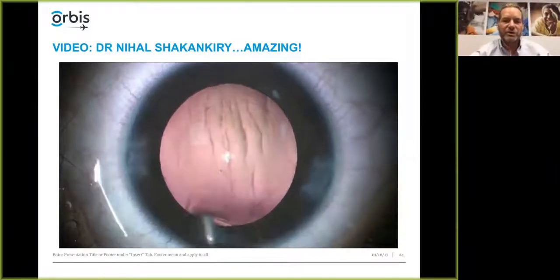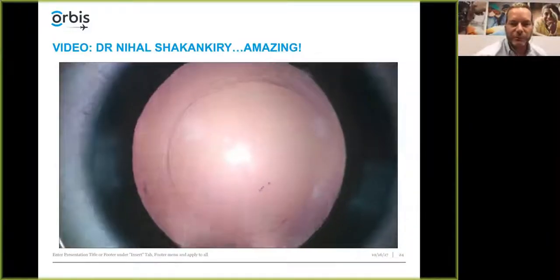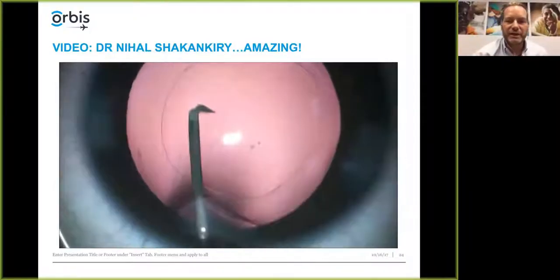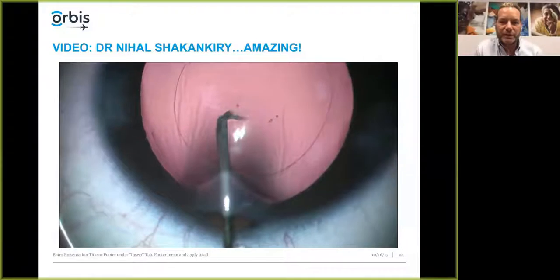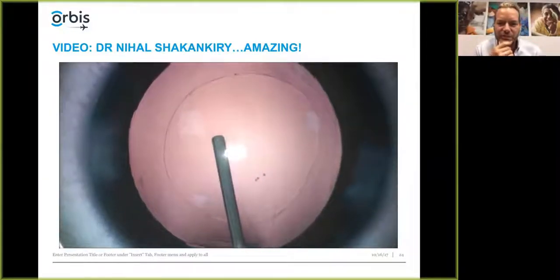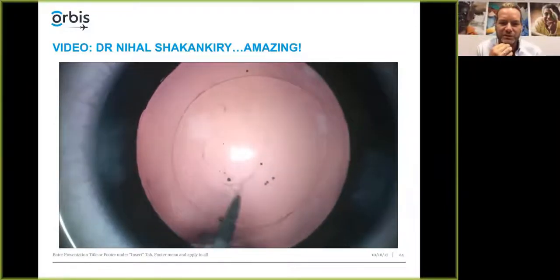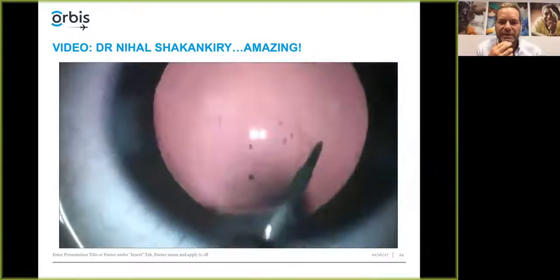Now, rather than going pars plana, she likes to do the vitrectomy from the front, and she likes to do it before the lens is implanted. And I know this is appealing to a lot of people who maybe don't want to go through the pars plana. So here she's made a small nick in the posterior capsule and is putting a little viscoelastic to lift the capsule off the anterior vitreous face, and now does a manual primary posterior capsulotomy.